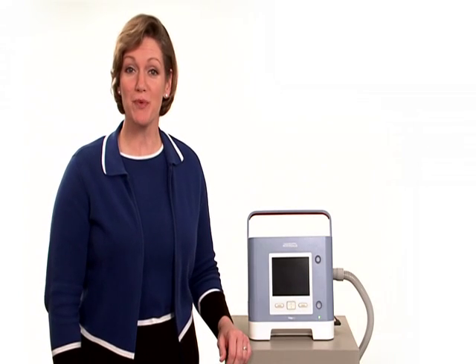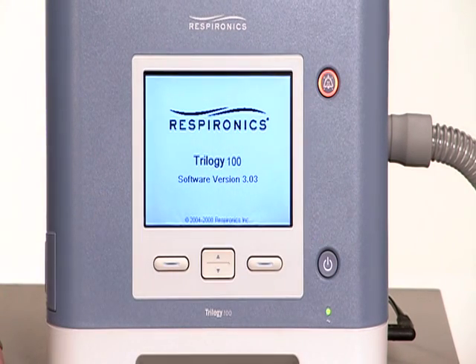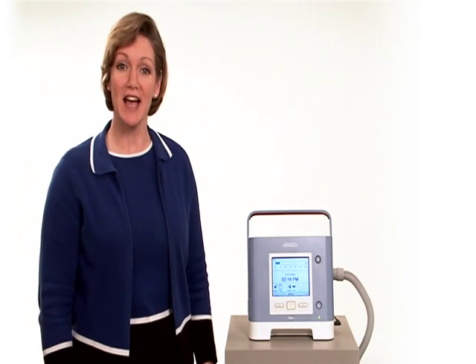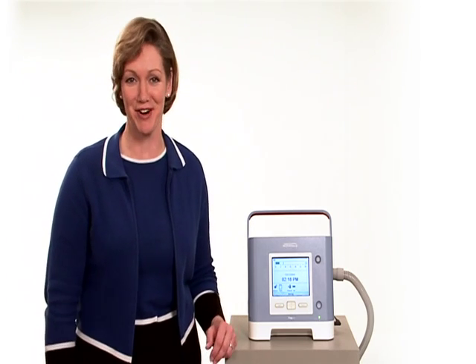To operate Trilogy100, you must be familiar with the screen display. In this segment, we'll review some of its symbols and operations. Press the Start-Stop button on the front of the device to begin therapy. The display screen and the backlights on the buttons turn on. The red and yellow alarm LEDs turn on momentarily, and an audible indicator lets you know that therapy has started.